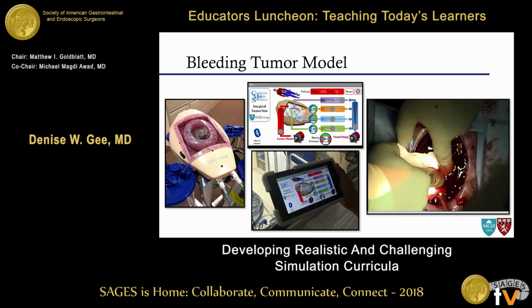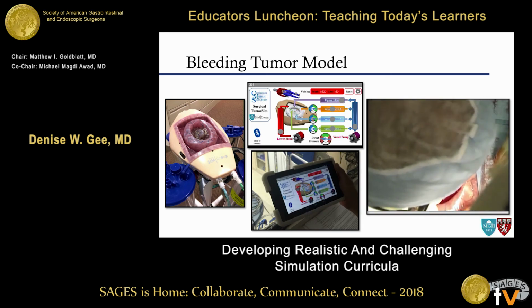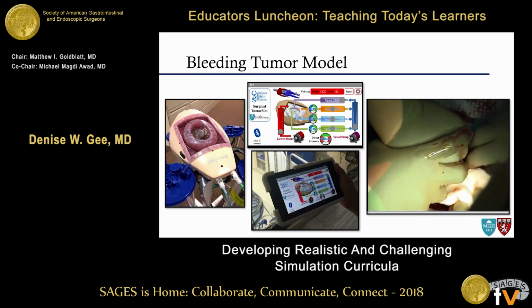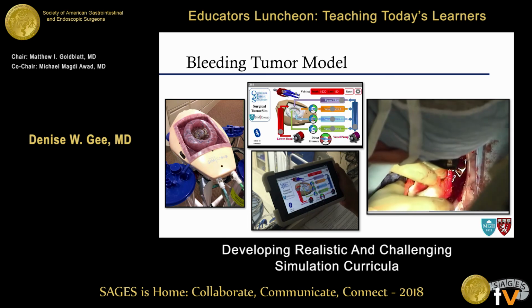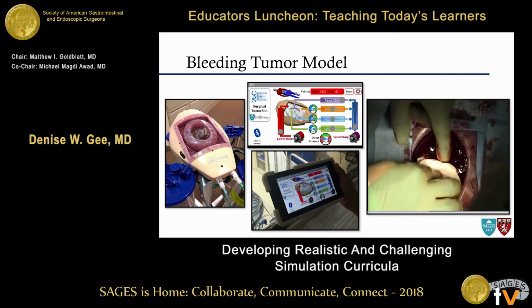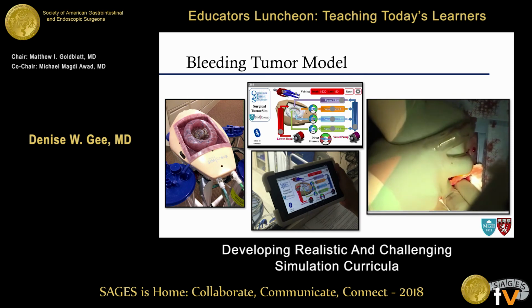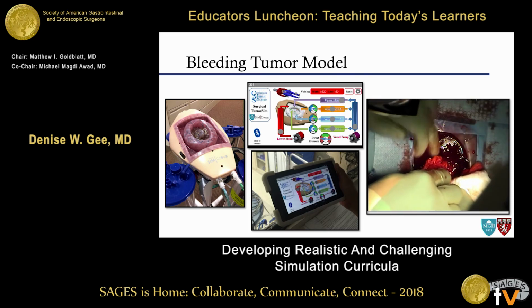After collaborating with some more engineers, we advanced that model. This is that bleeding pluot that's no longer a pluot. Now this is a bleeding plastic model that we can drop into a pelvis, a chest, an abdomen, whatever you want. There are certain controls here, and you can control the model off an iPad. As you can see in this video, it's actually quite realistic. The blood just keeps pouring out no matter how much pressure you put on it. The blood just keeps on flowing.